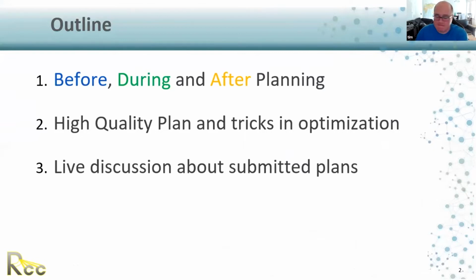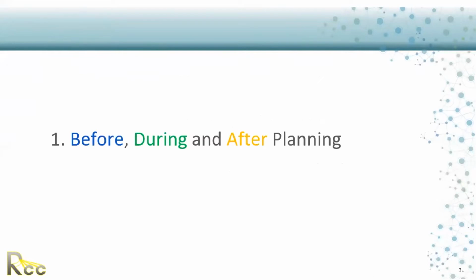Sure. So basically the outline will be before, during, and after planning. So we'll go and pause and understand the concept of that in each session. And then we talk about high quality plans and tricks in optimization. And lastly will be the live discussion about the submitted plans. So let's start first with the before, during, and after planning.